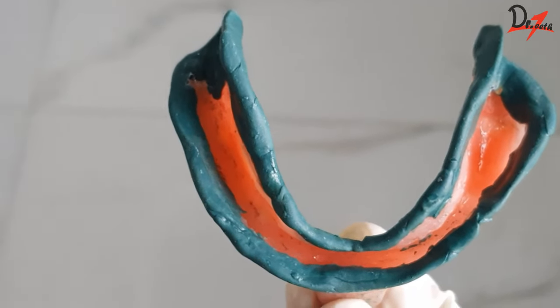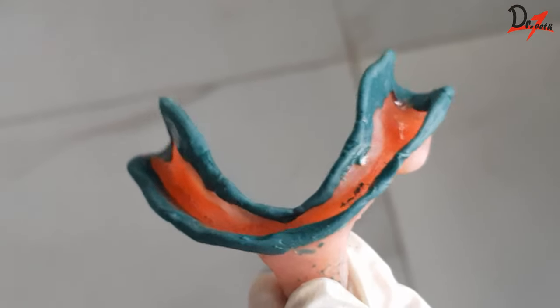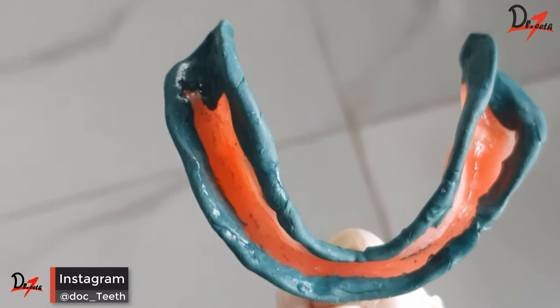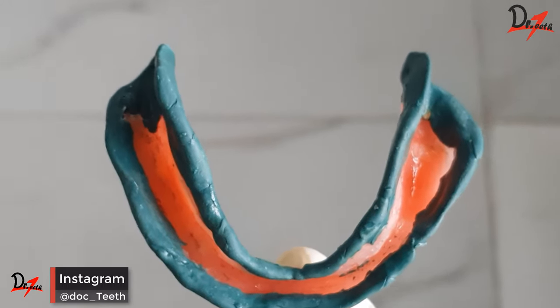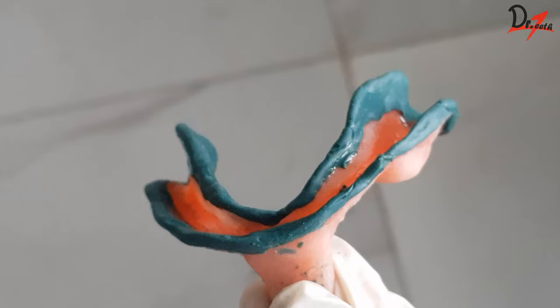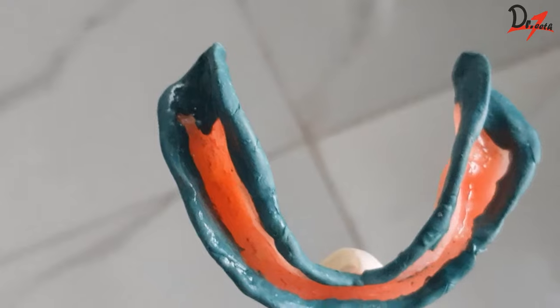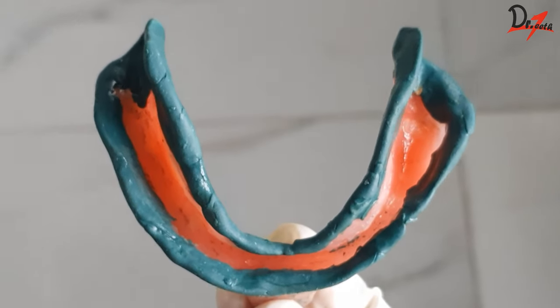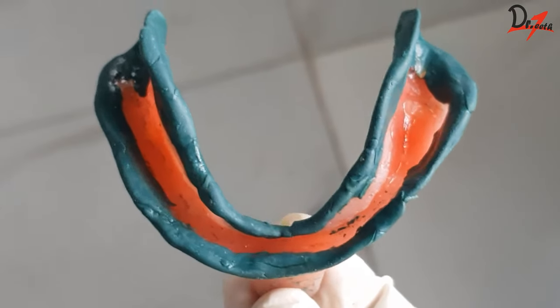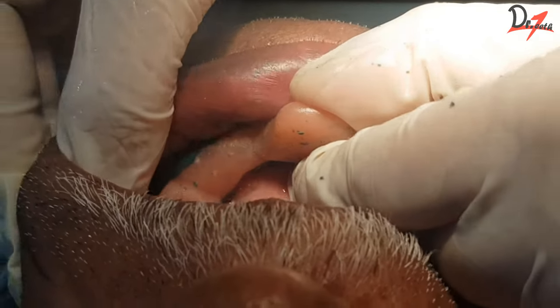To check whether the green stick material is underextended or has properly contacted the tissue, just check for dull areas. Wipe it completely with dry cotton. If the green stick areas are dull, that means the tissue contact is proper. But if you find any shiny areas in between, it means the tissue contact is not proper and you have to add more material in that area. This is our completed mandibular border molding.